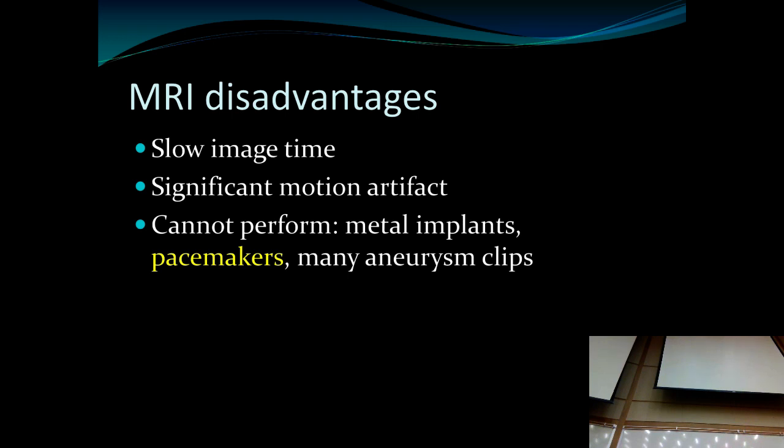All right, so really important here that we can't do an MRI scan in certain indications. The biggest one is a pacemaker. In a recent development, there are some MRI scans that are compatible with pacemakers, but these are not available in most facilities. So it's really important, if you're ordering an MRI scan, that you ask the patient several questions. The first one: do you have a pacemaker?